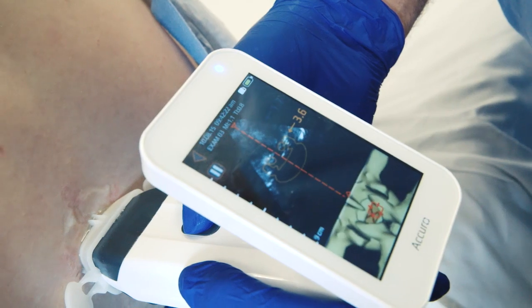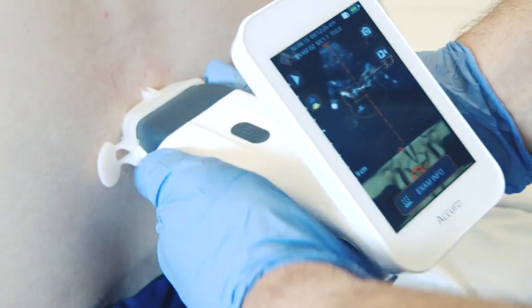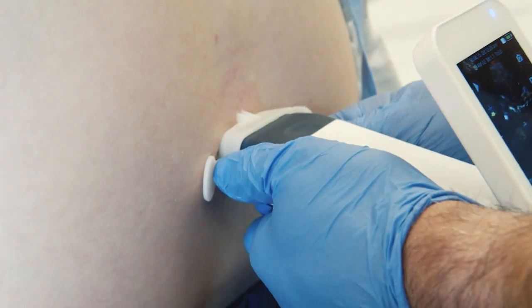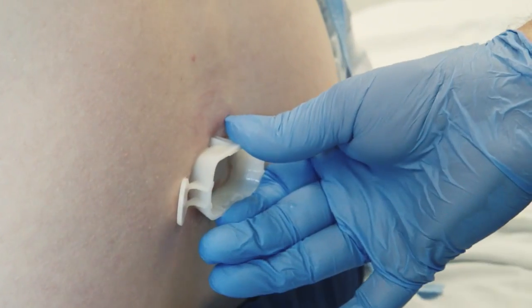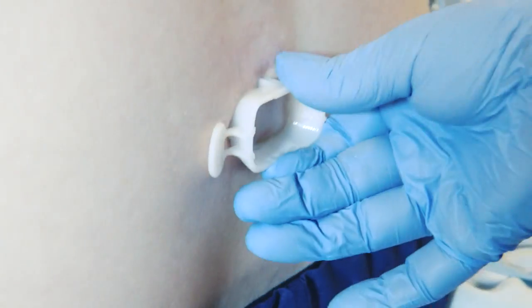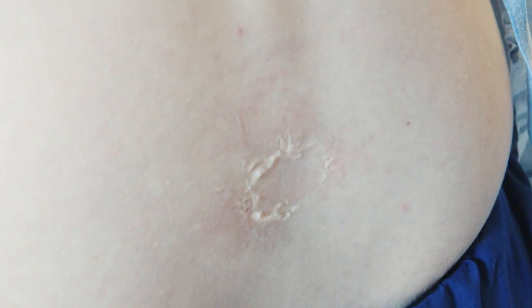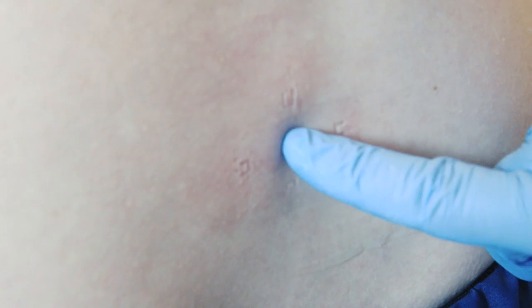Disengage the Acuro locator needle guide and press gently against the skin to mark the location. If the Acuro locator is not used, note the skin position corresponding to the middle of the transducer face using a preferred method such as a surgical marker.